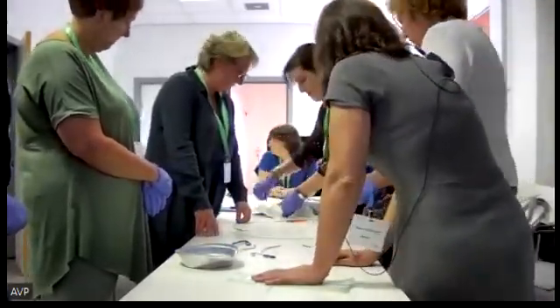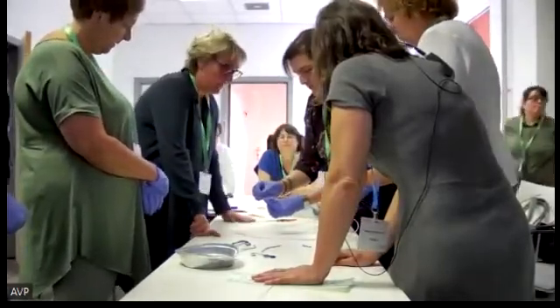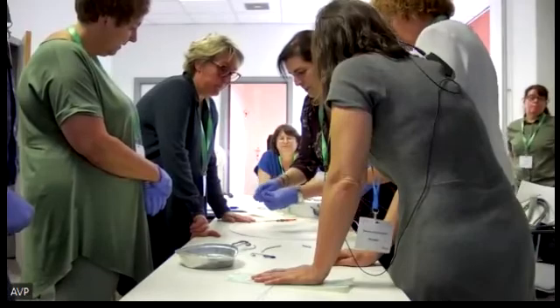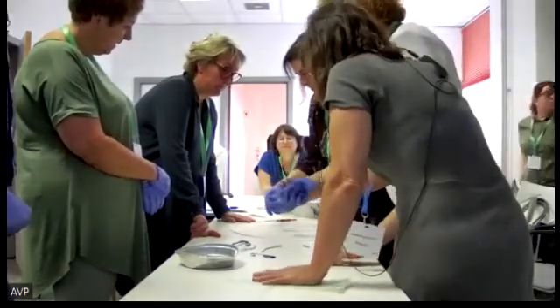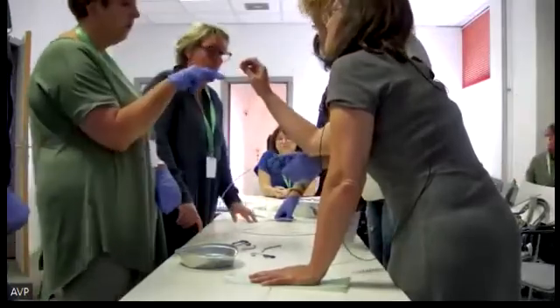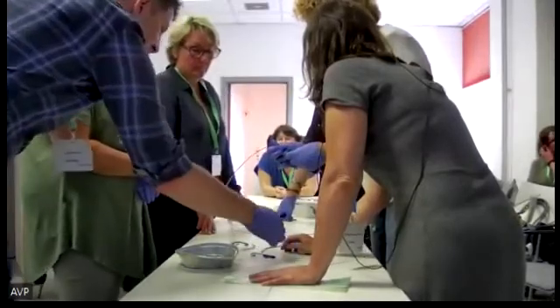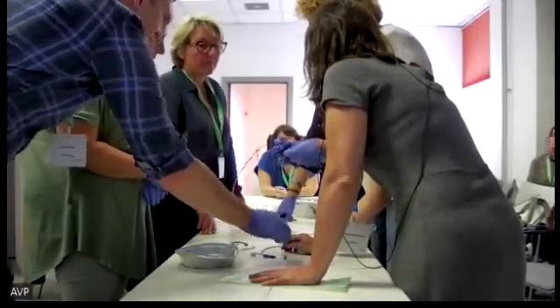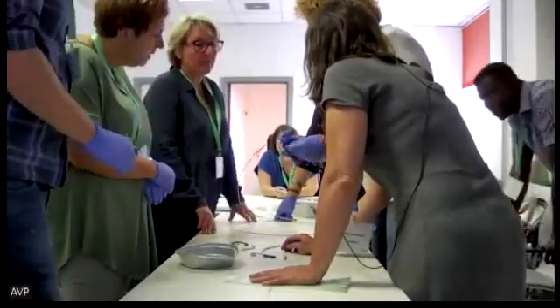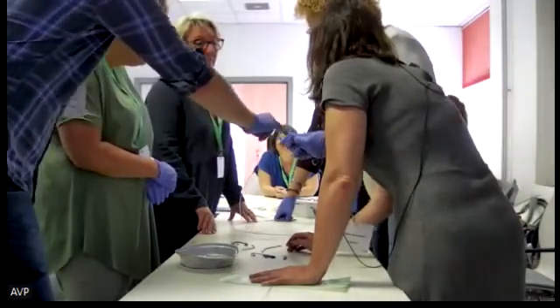So you put the first, short one over the inner sheet. Then you have a radiopaque marker, here, this is the dolphin. Do you see the radiopaque marker there? You go in and go out. Wait, where is the hole? You see it? Yeah, it's difficult.